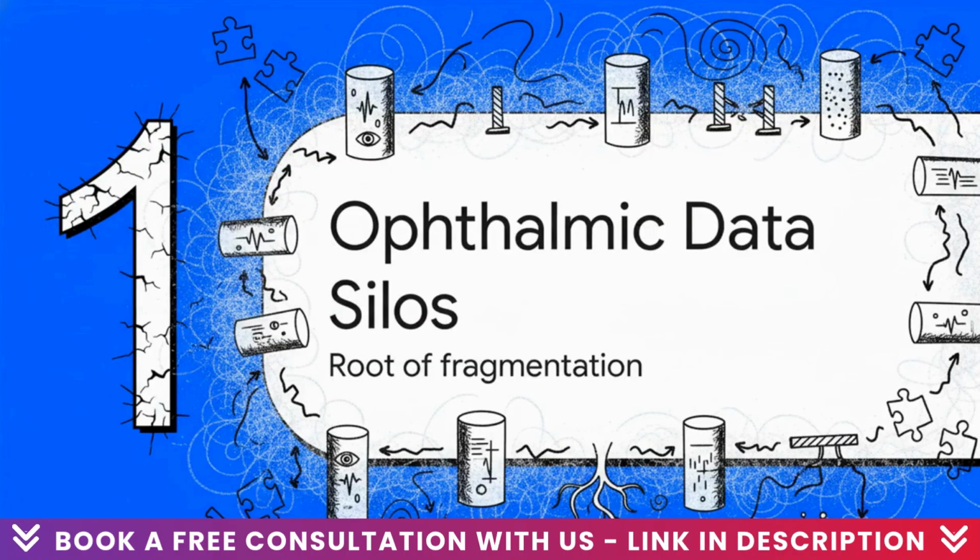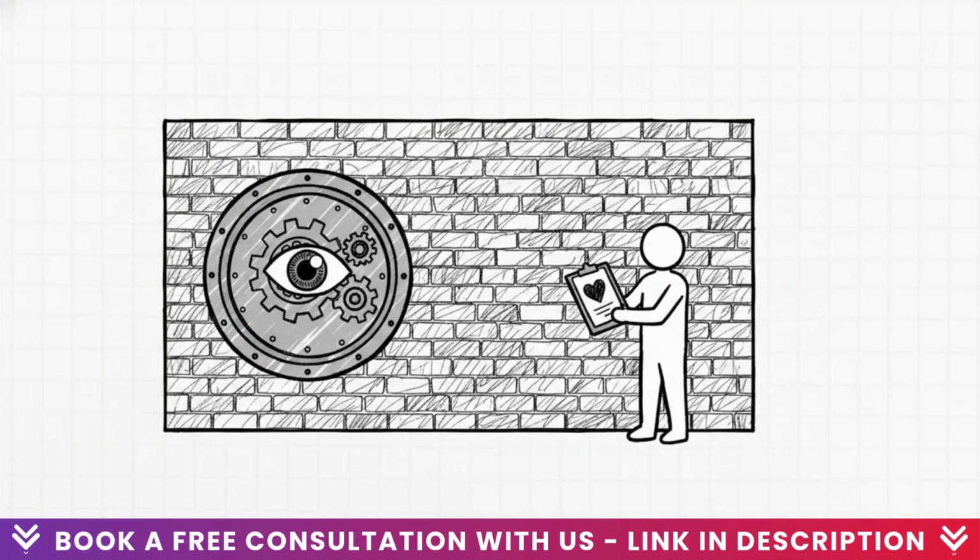All right, jumping right into part 1, the ophthalmology data silo. Let's get to the root of the issue. PACS is fantastic for what it does, saving massive, high-res pixel data. But let's be honest, it just wasn't built for seamless integration with clinical workflows. The real gold, the metadata about the scan, machine settings, the timing, is trapped deep inside those DICOM headers, and anyone who's dealt with this knows those headers are notoriously stubborn to extract and map to an EMR. This fragmentation literally builds a brick wall between the raw image and our holistic view of the patient.